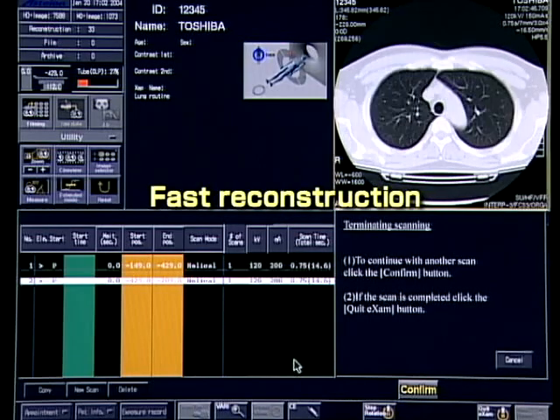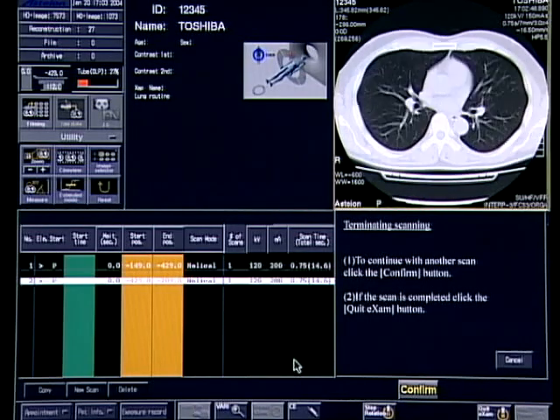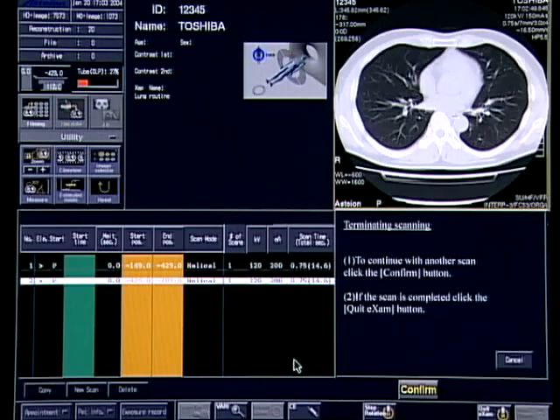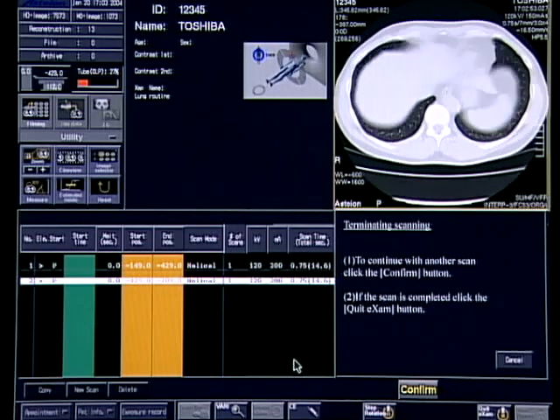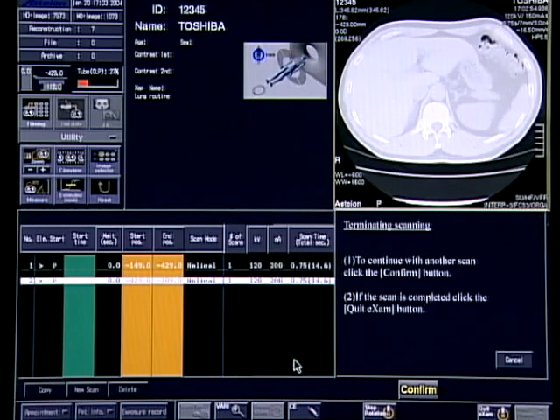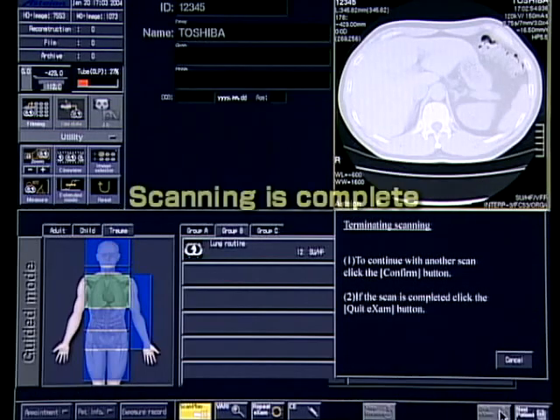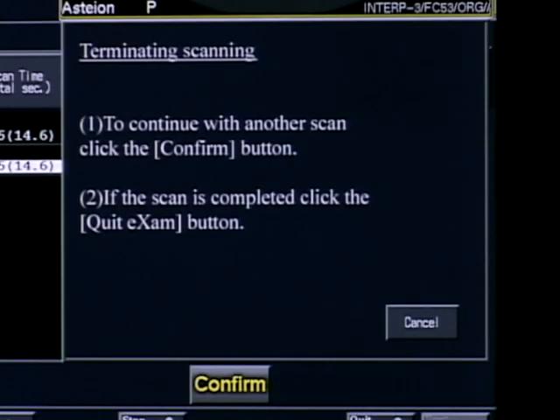Reconstruction is performed at a high speed of 4 images per second. With the completion of reconstruction, the examination is completed. Wasn't that simple? Astian Super 4 allows even an inexperienced operator to perform after-hours emergency examinations without anxiety.